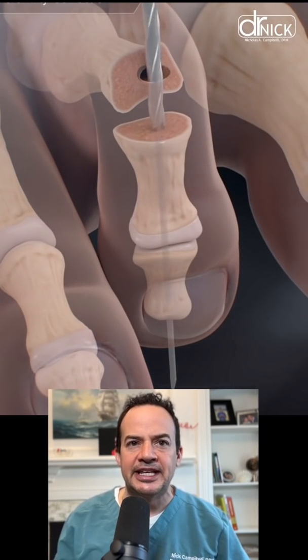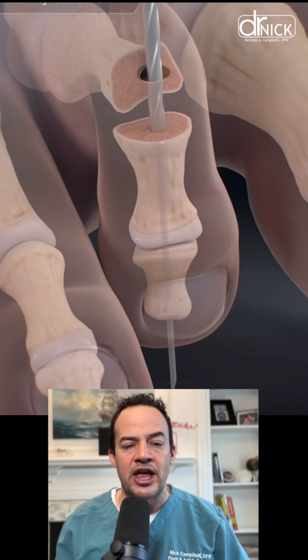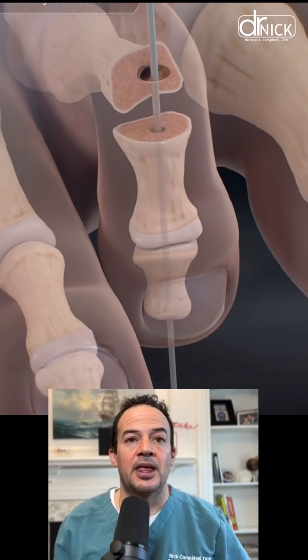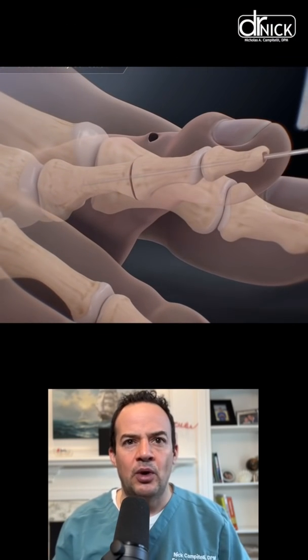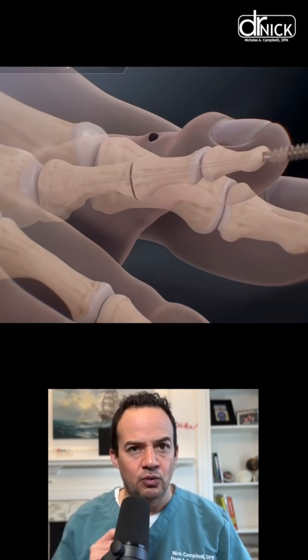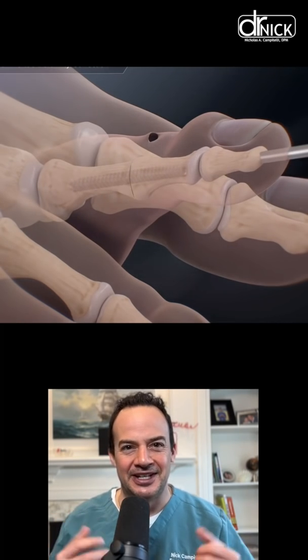Now we're drilling into the other end of the bone and we're going to put these two ends of bone together and fuse them in place with the screw. The wire is now being passed through the end of the toe. We put a screw over that wire and that screw goes across one joint and then goes into the other joint where the contracture or the deformity was, and the hammer toe is fixed.